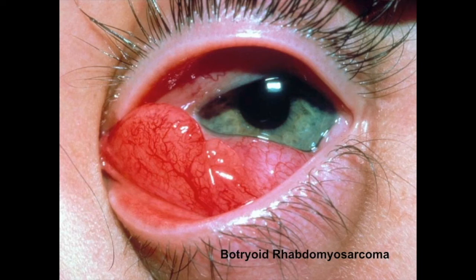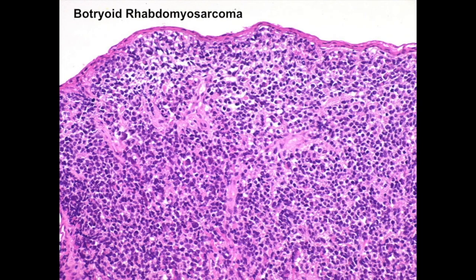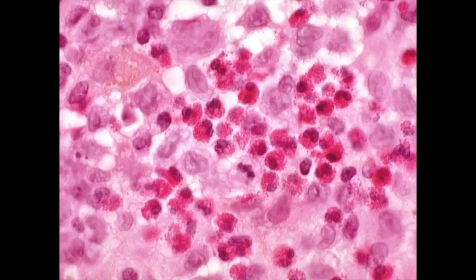This is a botryoid rhabdomyosarcoma, a rhabdomyosarcoma associated with mucous membrane. It's termed botryoid because it has this fanciful resemblance to a bunch of grapes. This is an old case from Lubbock, Texas. I remember talking to the clinicians involved in this case. They said they could see the tumor grow from morning to evening rounds. Here's histopathology of another botryoid rhabdo associated with the conjunctival epithelium.